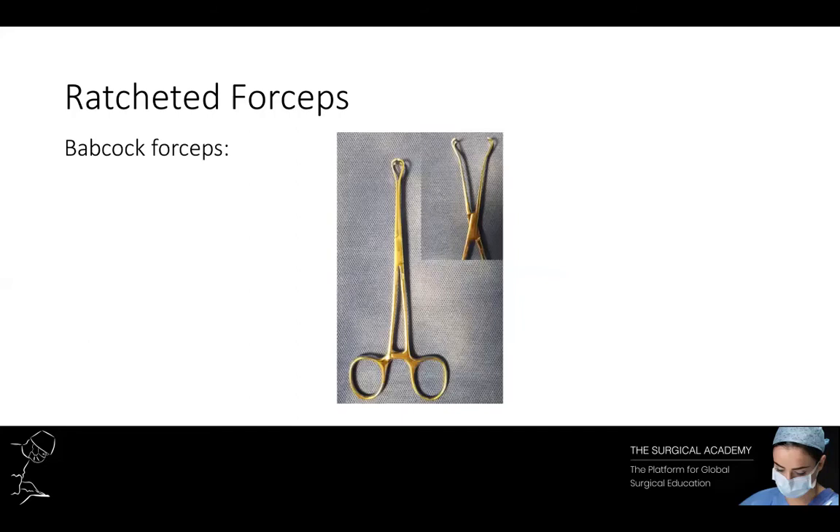Here we can see Babcock forceps. These are jawed instruments with a smooth end. This allows for more delicate structures to be handled without causing trauma. You would use Babcock forceps when dealing with bowel.